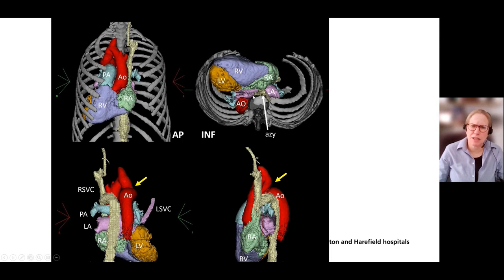And of course, the pulmonary veins, you see here a little bit in the inferior view, squeezed together a bit and elongated. So kind of a funny rotation as well. And please also note that this patient has quite a substantive kinking in her aorta. Instead of having a normal aortic arch, there is a very tough kink here, which prevented us from contemplating a retrograde approach much earlier.